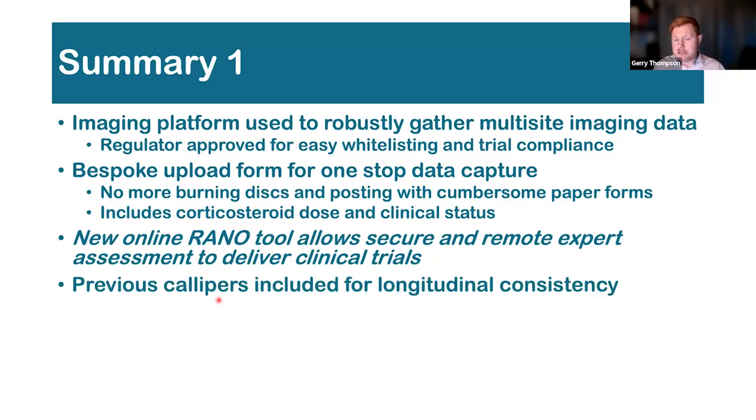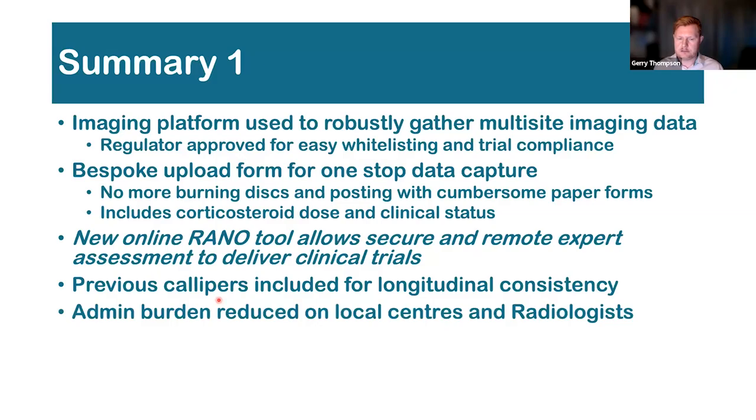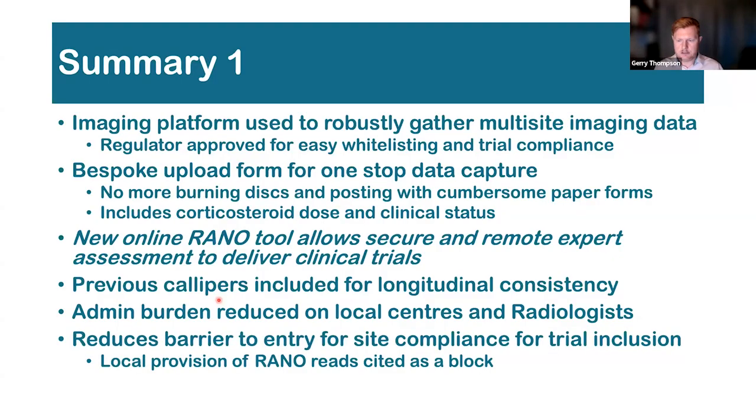And as part of that, as a radiologist, I can say that this capture of previous calipers, looking at what the previous radiologist measured, is really important for longitudinal consistency and is something that I've found always lacking from previous RANO assessments. And that reduced admin burden on the local data managers and radiologists hopefully will make them more likely to, A, join up for a trial, but B, continue and have a high volume of data upload and contribution rather than just 1 or 2 cases occasionally. So we're reducing that barrier of entry to site compliance and trial inclusion.